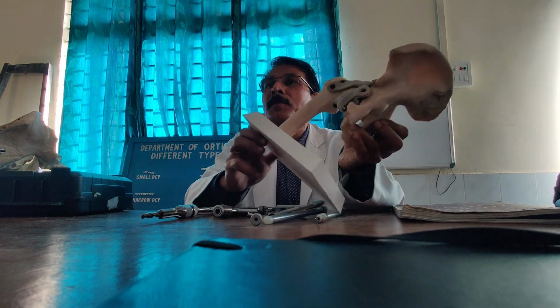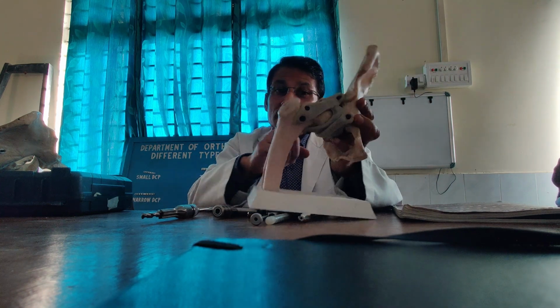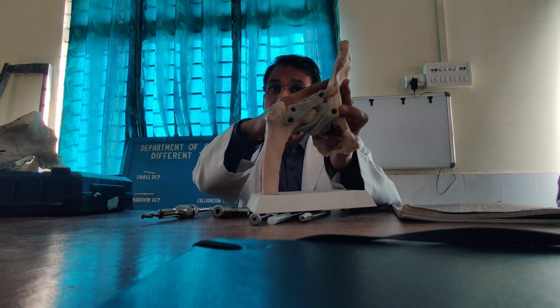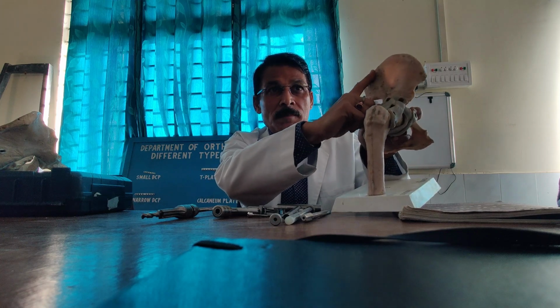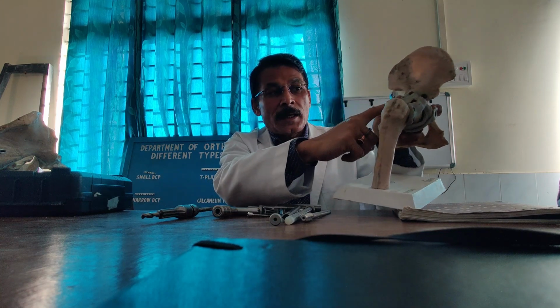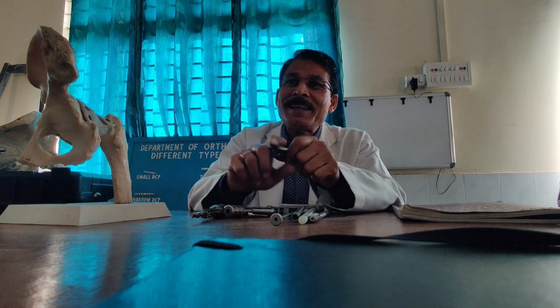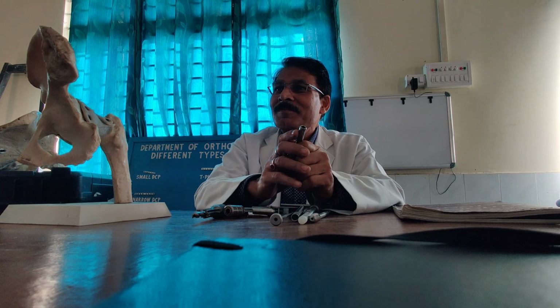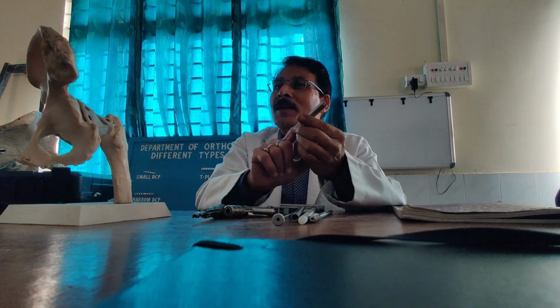So this is around 150 degrees. Almost. So that means the angle at which weight is coming. Most of the weight is borne by this part, the posterior part of the pelvis, and this is coming like this. So this weight bearing angle is not the same as that of your CCD. So this is around 150 degrees. So ideally, I am supposed to place the implants in the axis of weight bearing. So if you are going to do so, that means the angle should be what?